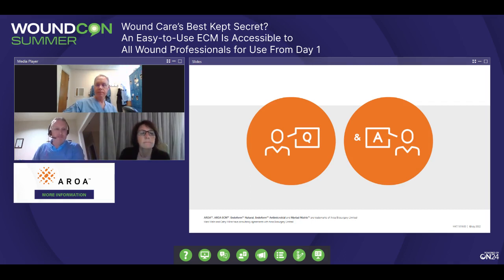Absolutely. Perfect. Thank you very much. The next question is, how early in the treatment process is it appropriate to begin treatment with Endoform? I start as soon as my wound is clean.